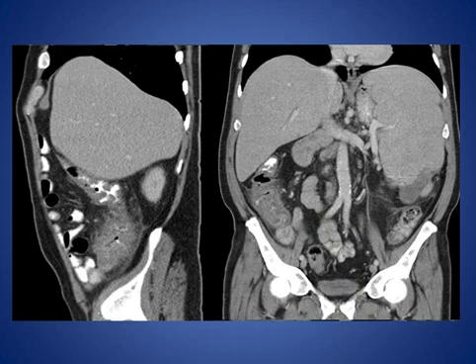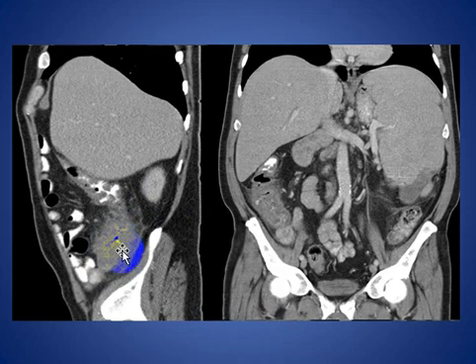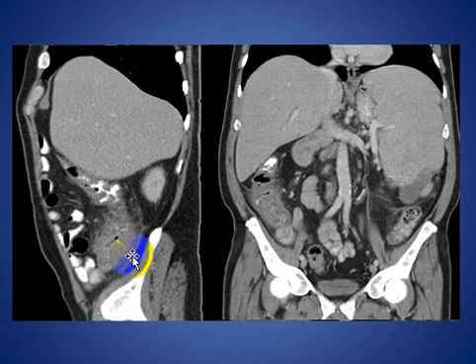CT in general shows thickening of the cecum, as we see here. It may extend to the ascending colon or terminal ileum, associated with fat stranding and thickening of the overlying fascia or peritoneum. Sometimes we have pneumatosis intestinalis. Features of small bowel obstruction may also be seen, as well as intramural areas of low or high attenuation due to hemorrhage.